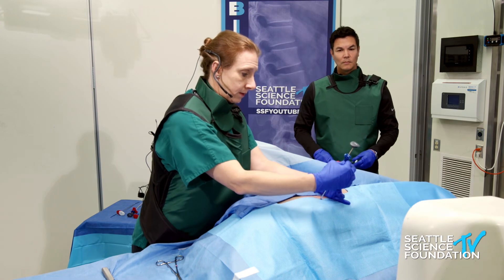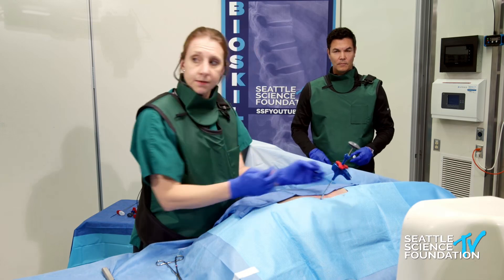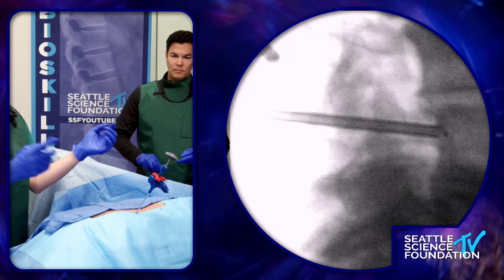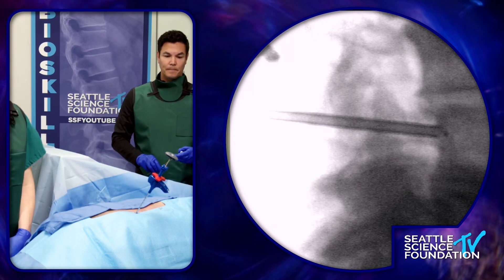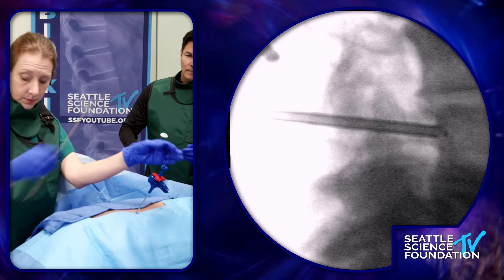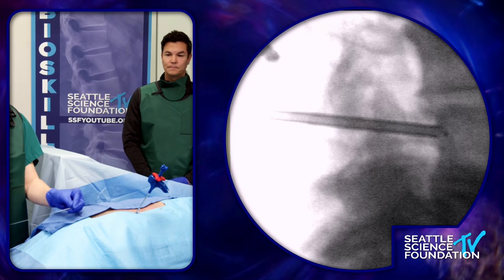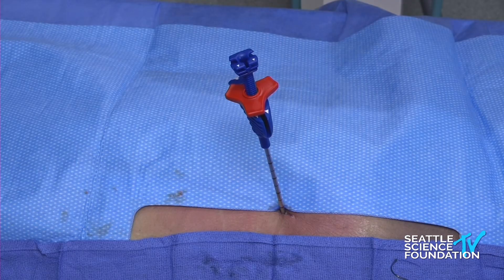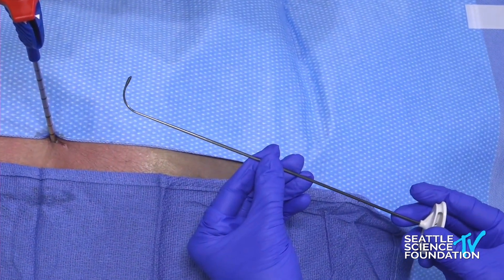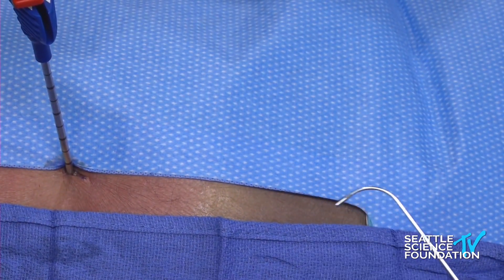This is the generation two system and it has a little bit more curve. You can see the radiolucent tip of that straight stylet. I'm going to remove that now and place the curved stylet. The curved stylet is metal, whereas the straight is a hard plastic material, so this one can be a little bit more difficult to advance through the first introducer cannula — that's why I put the straight tip in first.